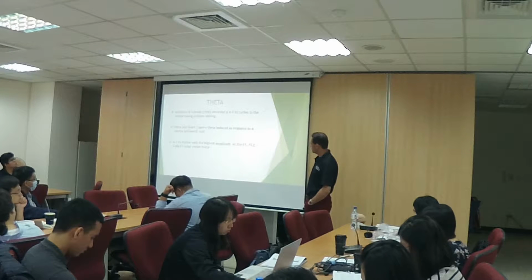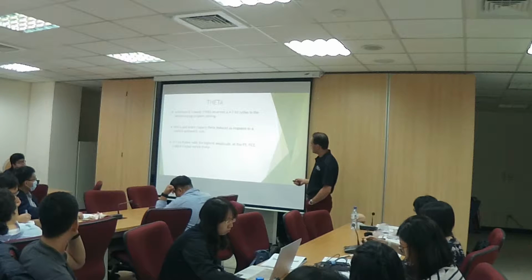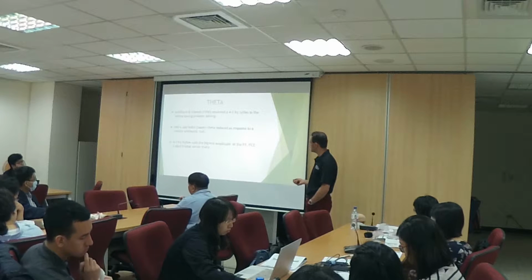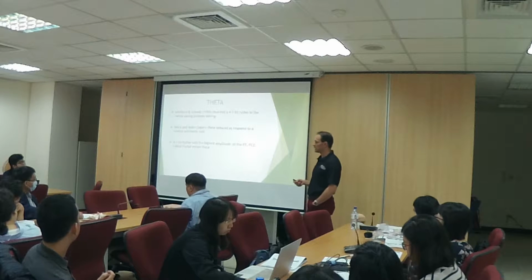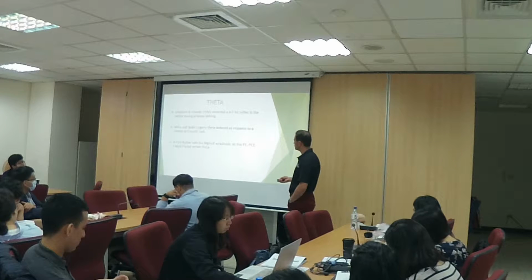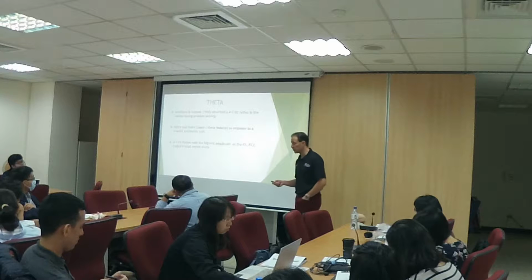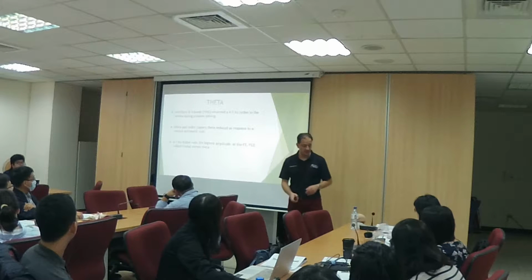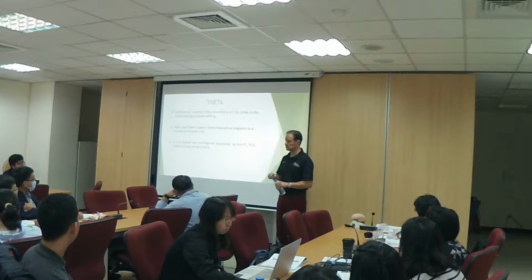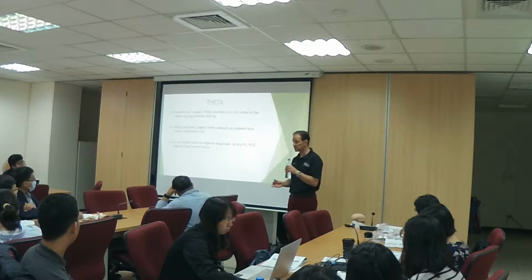So, some studies that have been done to identify certain types of algorithms, and you can do it with go, no-go tasks. So look at the ERPs and different types of things. And interestingly, Kropotov, if you can get Yuri Kropotov's book, Yuri Kropotov is the neuroscientist and is the designer of the Mitsar amplifiers in Russia.